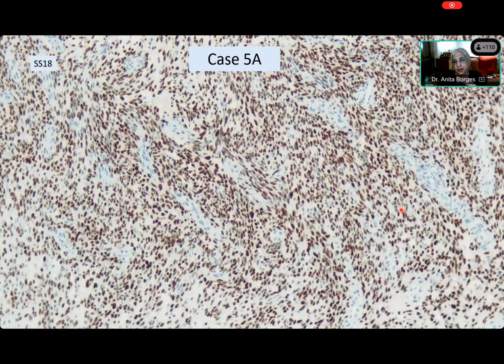And this is SS18 protein. Is it nuclear or cytoplasmic? Nuclear, ma'am. Nuclear. Very good. So now we know that this is a monophasic synovial sarcoma. All right. Very good. Excellent.